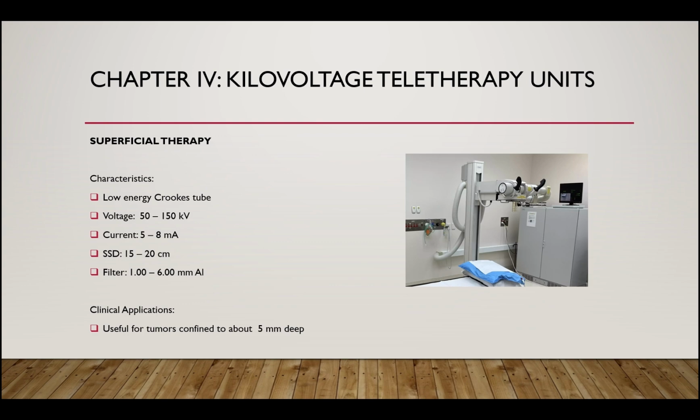So it is risky because when we deliver more than the calculated dose, when we go over the 5 millimeter depth, there can be overdosing of the skin. So dapat sakto lang. Sakto lang tayo or limit within the 5 millimeter depth. So that is for superficial therapy.